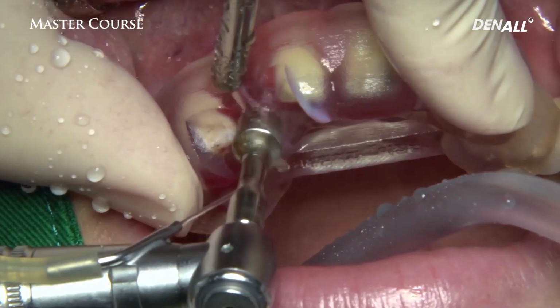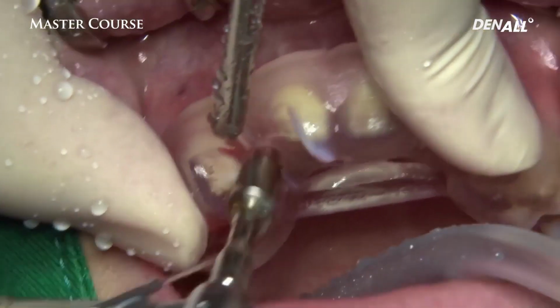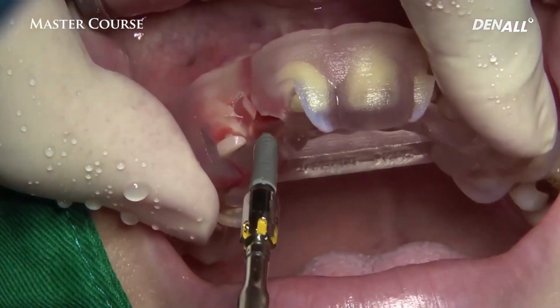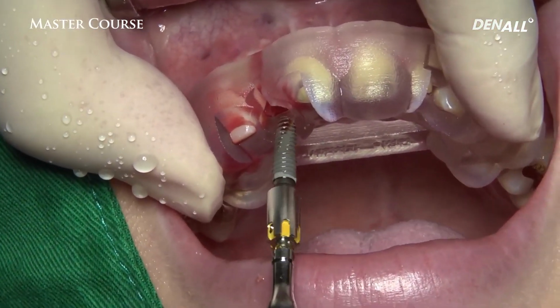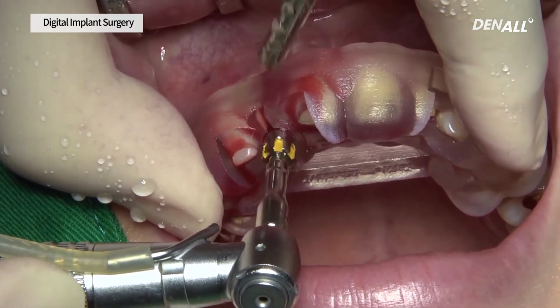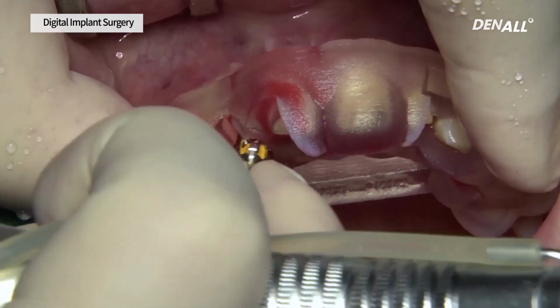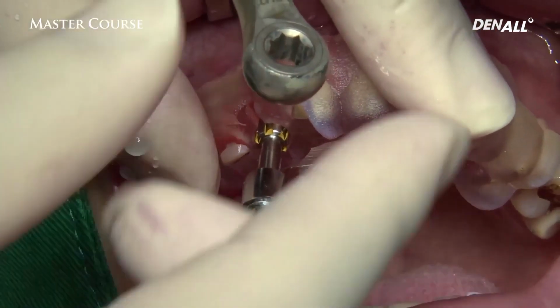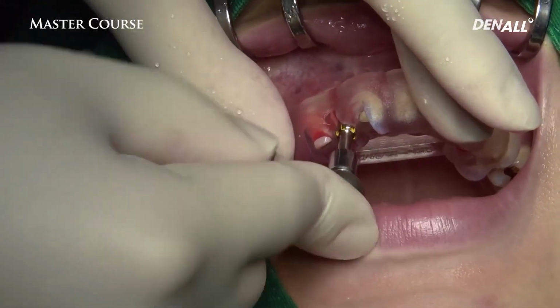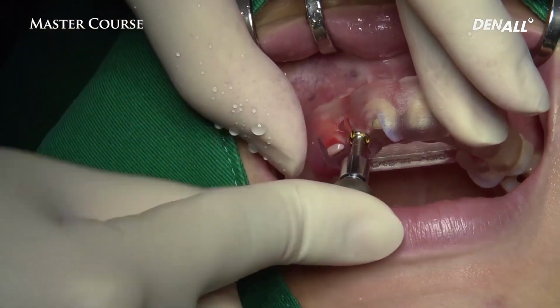First, the bone flattening drill is used to flatten the surface of the bone where drilling needs to be done. A tapered drill is used to expand the hole sequentially. After checking that the implant is sufficiently wet, the implant is placed. Here, the hole of the guided template is in line with the yellow line of the driver. Even the implant's hex position is properly placed as planned.